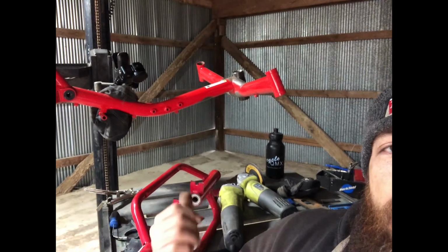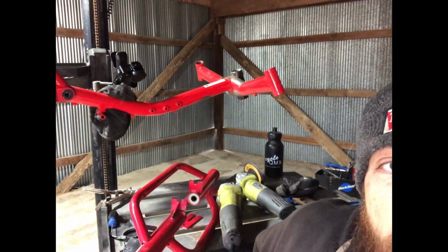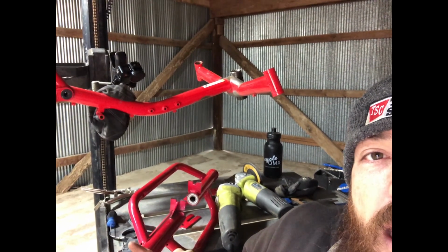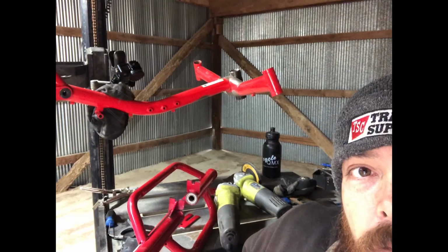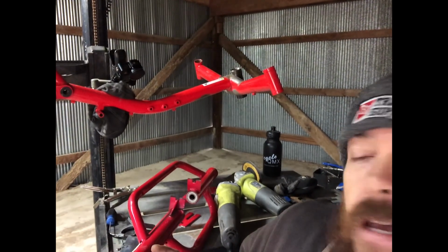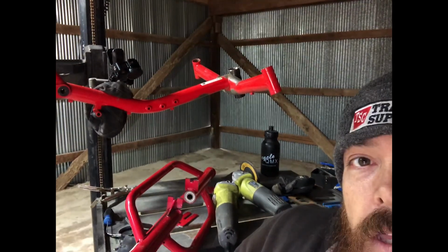I guess we better get back to work and living the dream over here. I've just about trimmed those off. I'm about halfway through on this one right here. And once I get those cut off, I'll go ahead and sand them down, grind them, clean them up, remove a little bit of the paint so that I go ahead and tack weld our new pieces on. Stick with us.